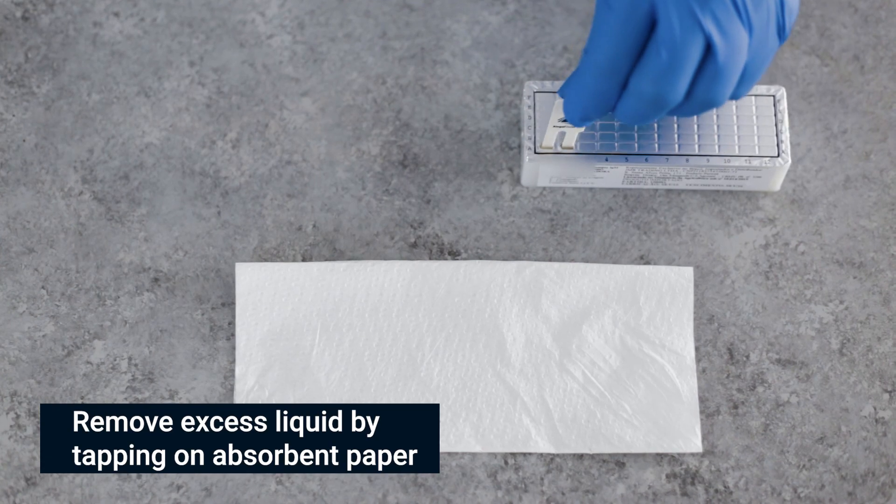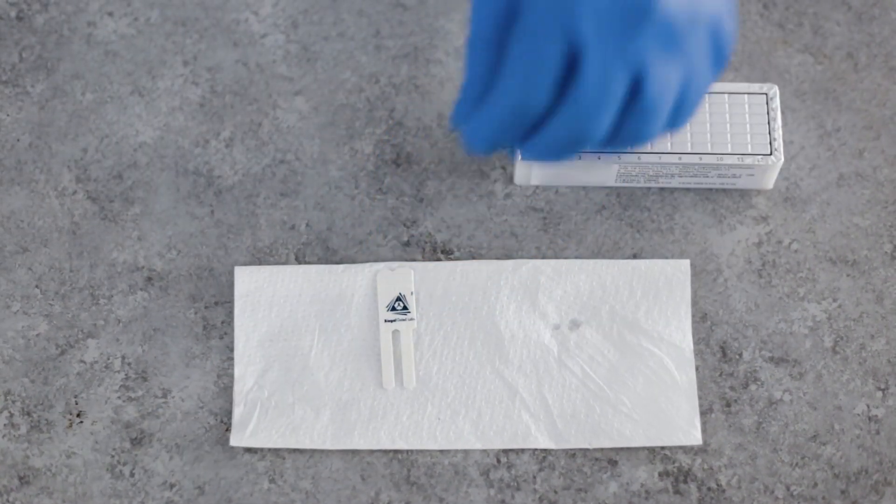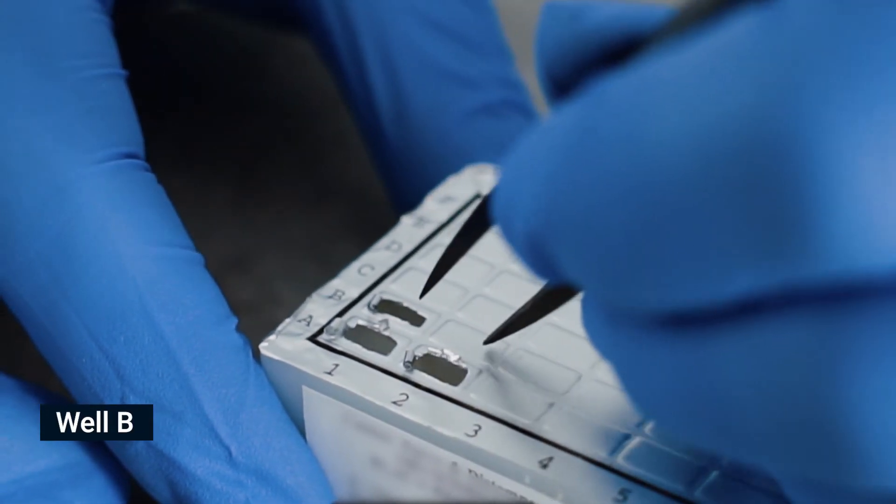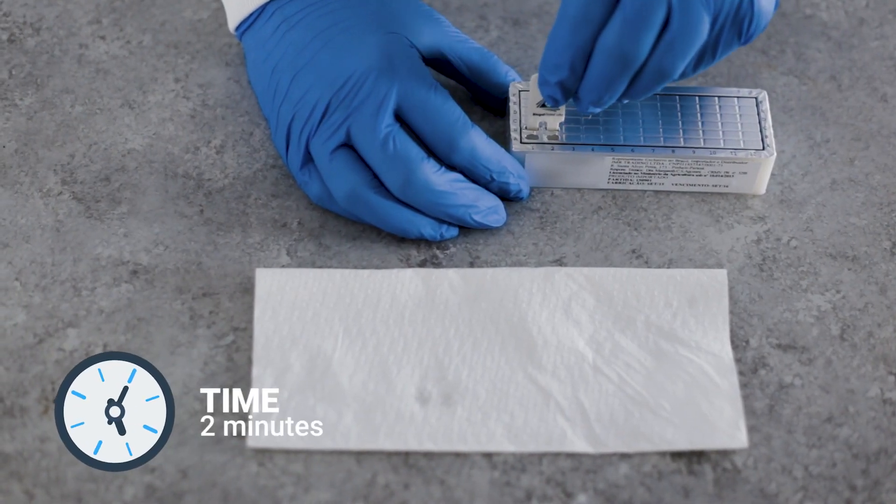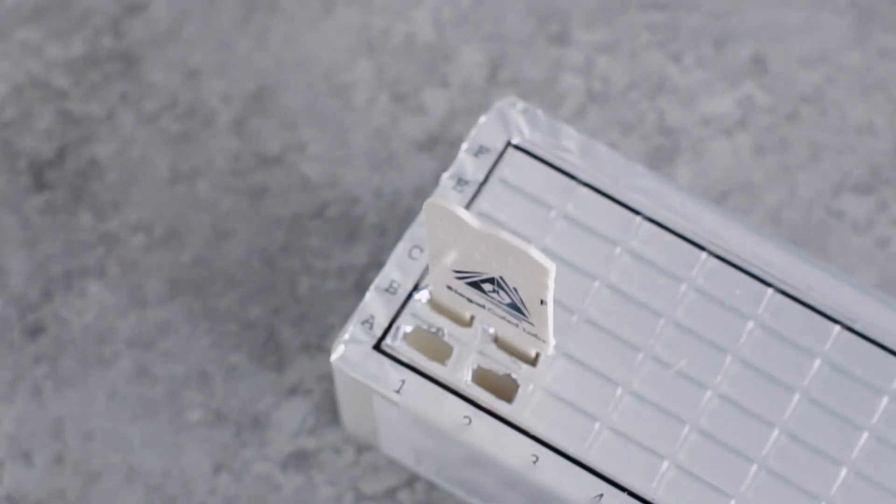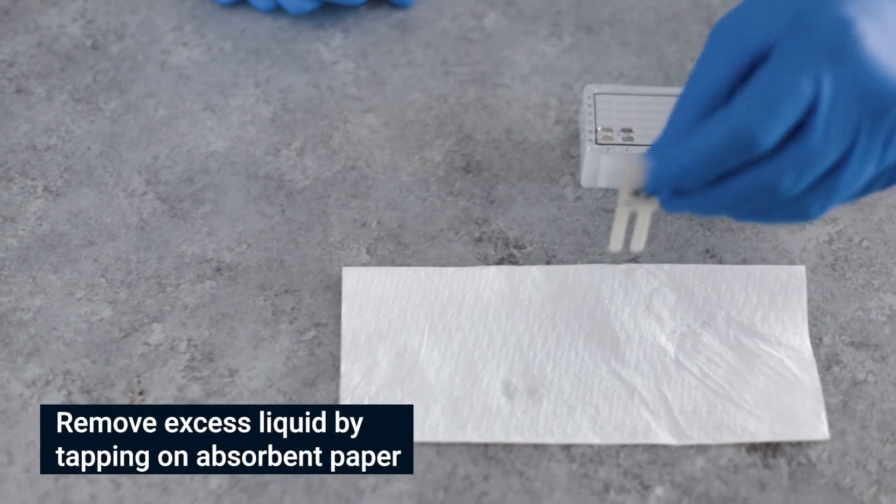Gently shake off excess liquid from comb teeth on absorbent paper before moving to the next row. Pierce the foil of the next wells in row B. Shake off excess liquid and insert the comb for 2 minutes. Move the teeth at least twice during this step, then remove excess liquid.